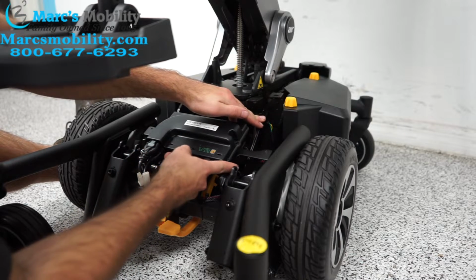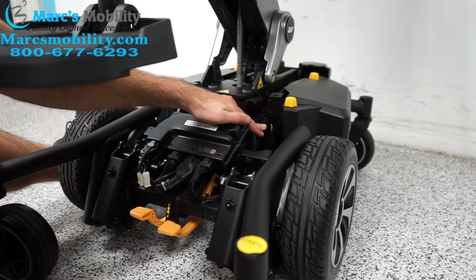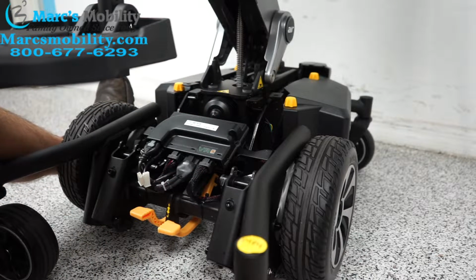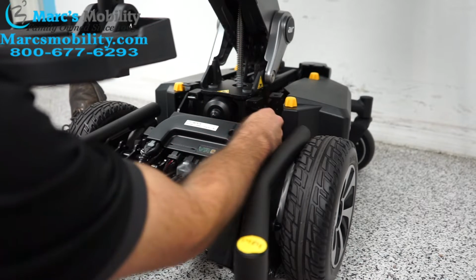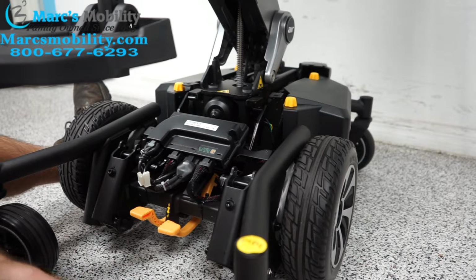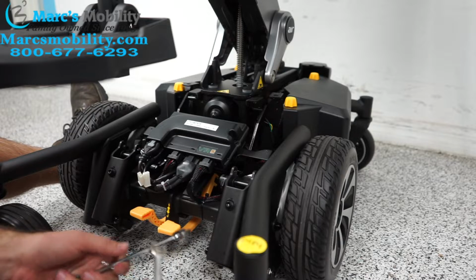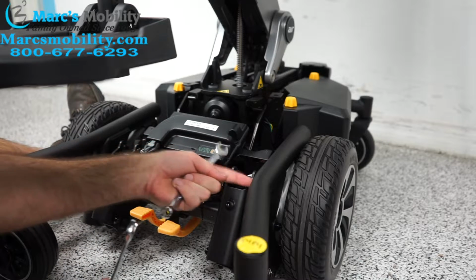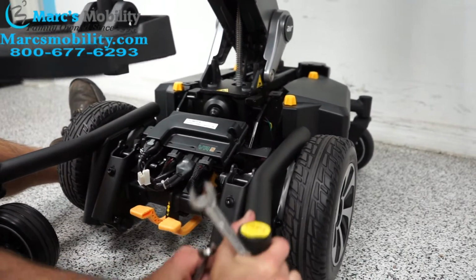This gets pushed down, it pulls on the spring, and it triggers a little button underneath here. So in order to loosen that, let's say it's too tight because this can wiggle. So that looks all right, but I'm going to loosen it just for example purposes. You're going to need a 1/2 inch wrench and a 10 millimeter wrench. So the 1/2 inch wrench, you can see this bolt going through right here. This is your suspension. It is tied to this caster system here.